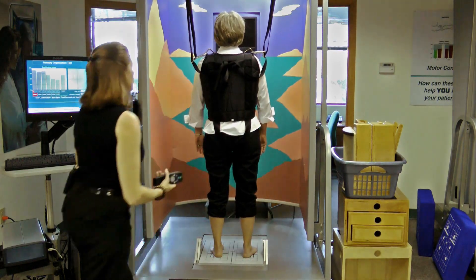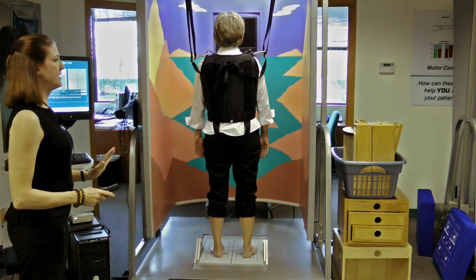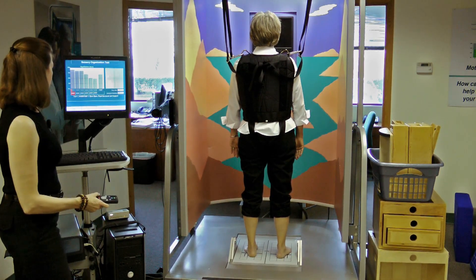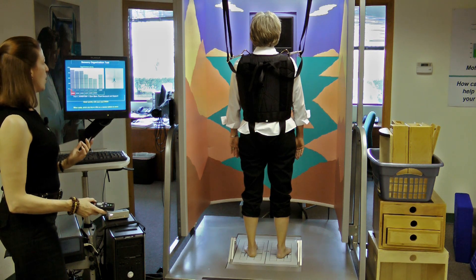Each test is 20 seconds long. During that 20-second test, you get to stand as steady as possible — no fidgeting, no nothing. In between the tests, you can move a little bit. The first test is very easy — you're going to stand quietly with your eyes open.